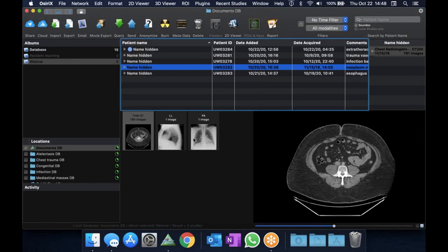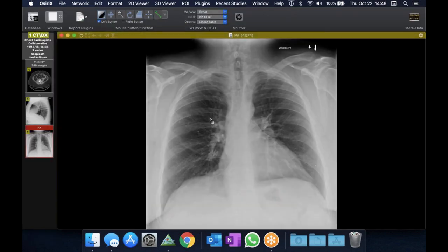All right, this is a good perception case. If anybody wants to take a stab, it's not particularly hard, but it's a good one for some junior residents or even some senior residents, on why we have to look at certain parts of the chest radiograph.